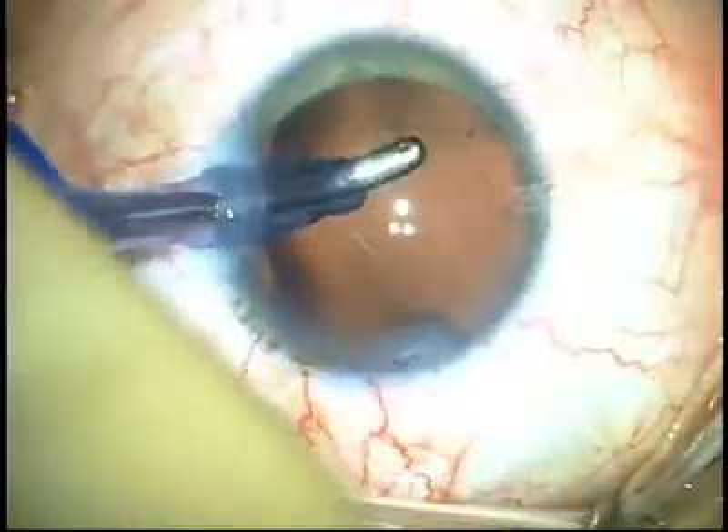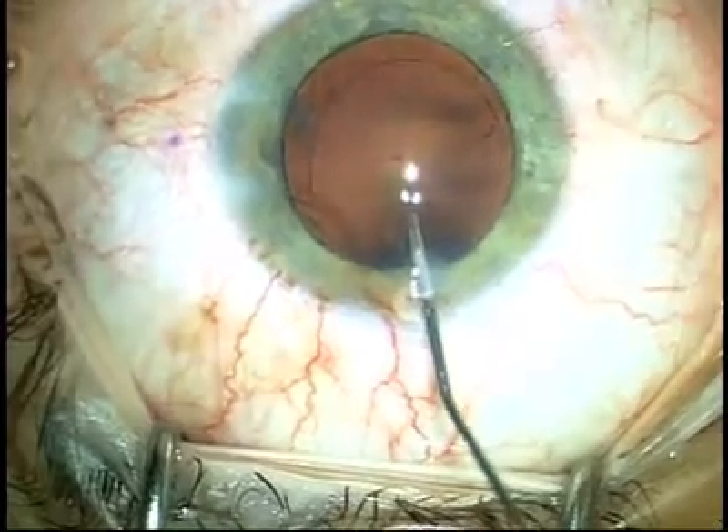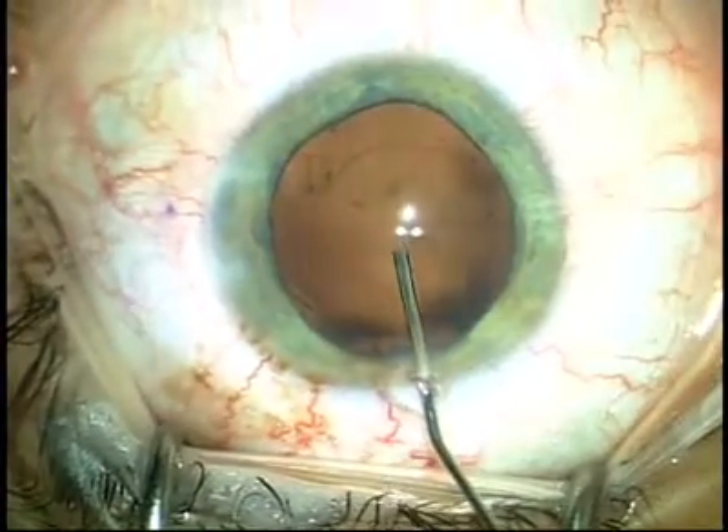As you can see, there is exquisite detail inside of the eye because of the lack of viscoelastic during the irrigation and aspiration.